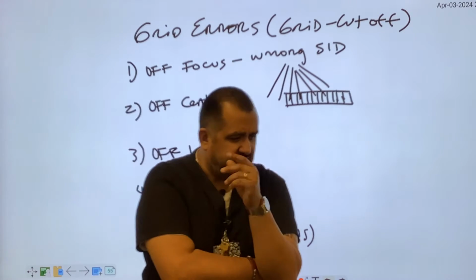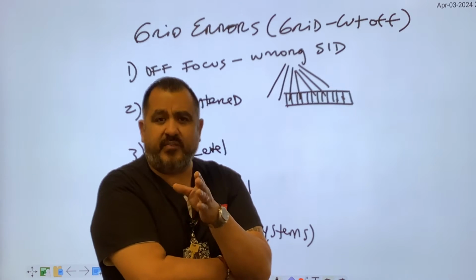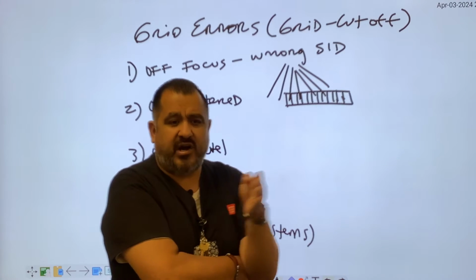In one of the textbooks, I think it's Kettering, they say lateral decentering is another term for being off-centered. Lateral decentered means you're off the center.